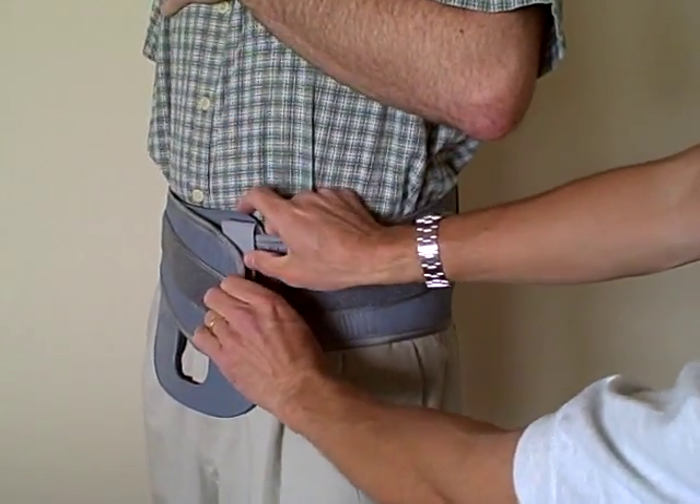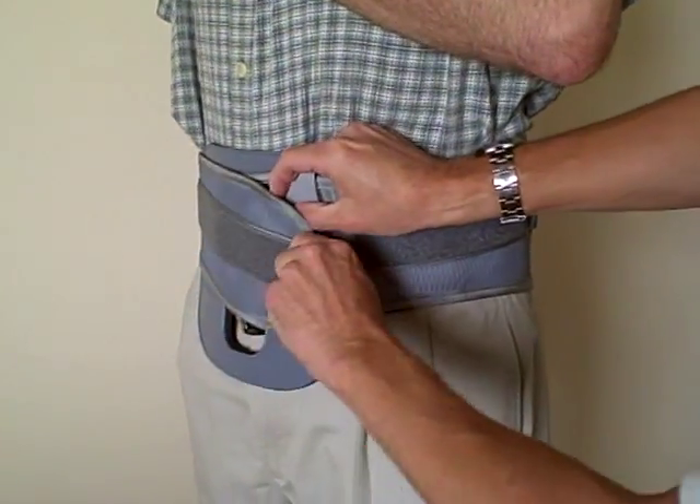If the patient needs to adjust it, they simply lift up on the Velcro, replace, and put it back down on the Velcro.